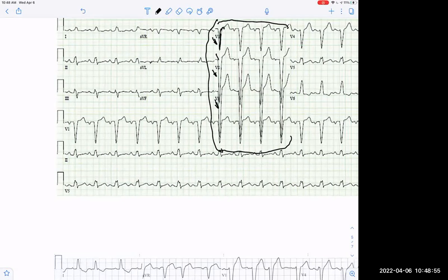Painting the entire picture here, this person has a defect in their left conduction system, their left bundle branch is blocked, probably diseased, and they're probably suffering from left ventricular failure. They've got some left ventricular wall thickening, left ventricular hypertrophy. So that paints the total picture, and it makes sense that this person has a left bundle branch block. The left part of their heart is really struggling. This is a sick heart. So that paints a pathological picture for us there.